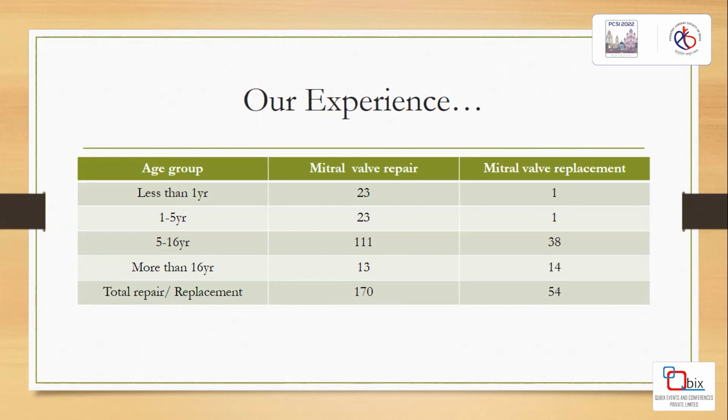And one of the things we've done is in older children like rheumatics, we don't accept imperfections. If it's a really bad valve, we replace with a mechanical valve, not a bioprosthetic. But if it's a younger child, we really go all out, repair and accept imperfections. In the older children with rheumatics, we repair the valve, provided the valve leaflet tissues are good.